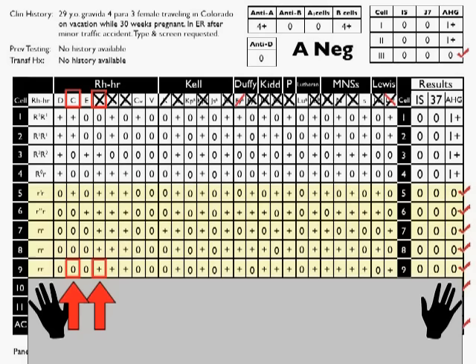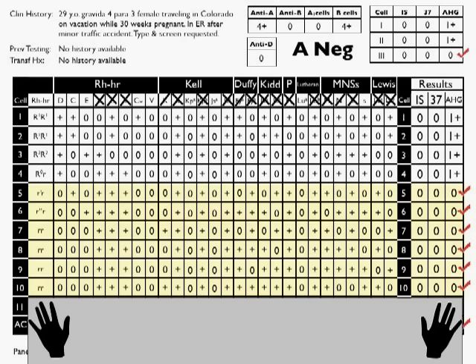Cell 10, which is the last one of the completely negative cells to look at. Let's do that one. Okay, we've already done the Lewis's, nothing to do there. Oh, good. Now here we have a double dose rule out for little s. Let's do that. Already ruled out M and N, already ruled out Lutheran B, already ruled out P, single dose, no rule outs, single dose, no rule outs, onto Kell, and again, nothing for JSB and KPB because we've already ruled them out. Here's another rule out for big K, so put a single slash there, and again, there's nothing new in the RH system that we haven't already seen and have not already ruled out.